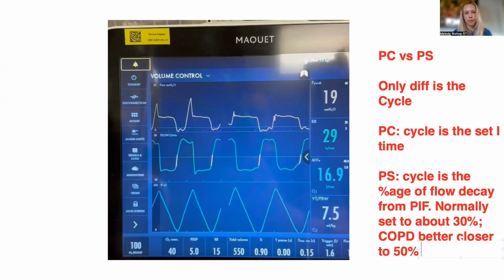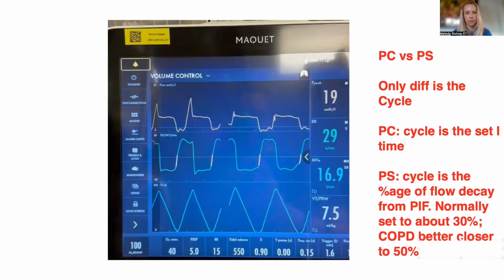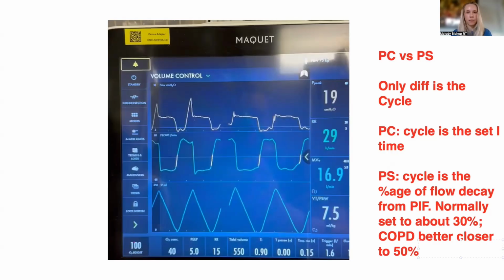So there are some small studies to suggest that patients with COPD do better with cycling percentages closer to 50%. Normally, and I put normal in air quotes because I don't know how it is with you or the Hamilton stuff, but if you pop the Servo over to pressure support, the cycle percentage is usually at 30%. And then if I see that they're trying to cycle the vent and the percent's too high, I'll go up on it. Like I'll go from 30 to 50 or whatever it is. If they want to breathe faster, or certainly if it's a patient with COPD or emphysema, I'll just go right to 50%.